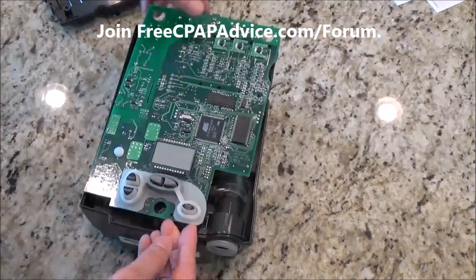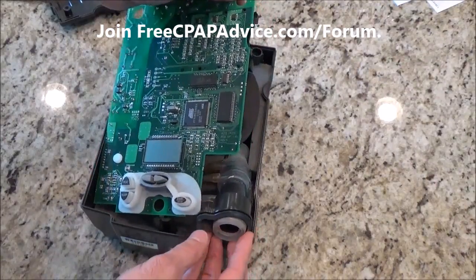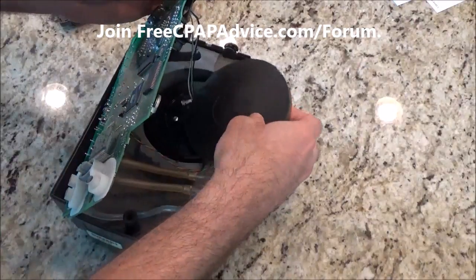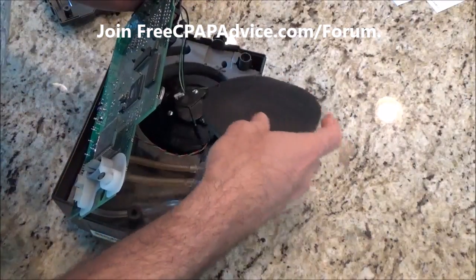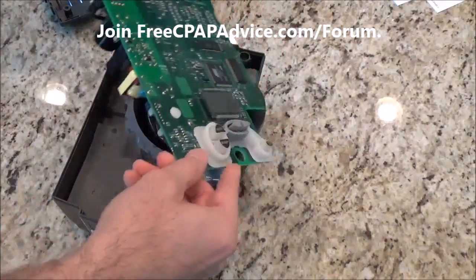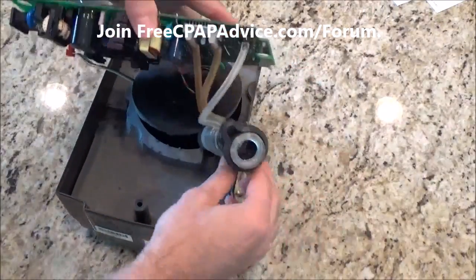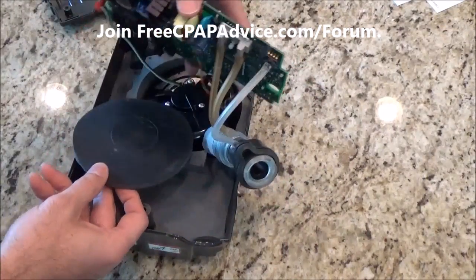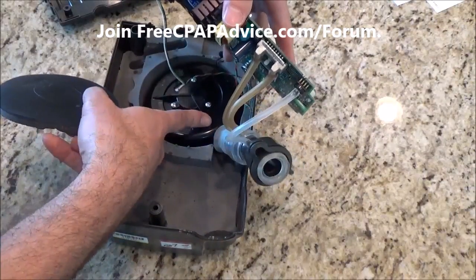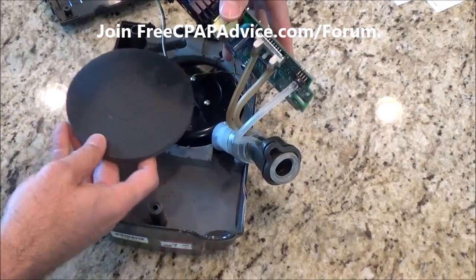So let me try to, okay. Here's where we plug in your CPAP tubing. And if I try to flip this over, ooh, man, there's all kinds of cool stuff in there. This is stuck. I'm gonna try to flip this thing over. What you see is this padding here. This was covering up this fan. This is like the flow generator. I'll try to take that apart and we'll see what's inside there.